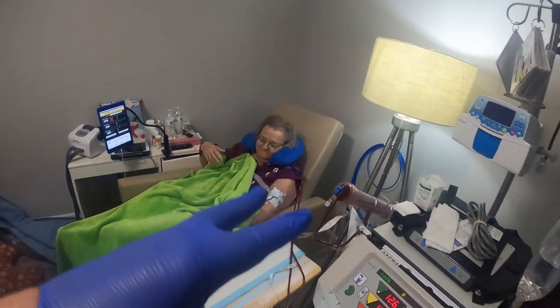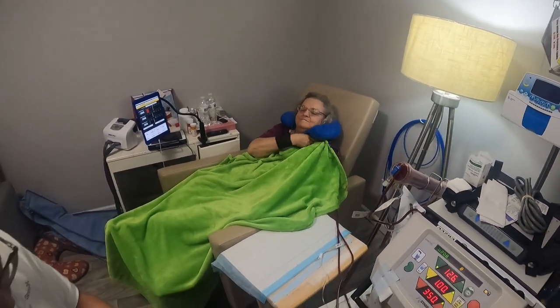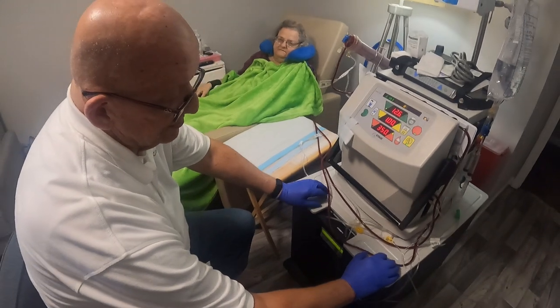It's nothing comparable, but when I overeat, all the blood goes to the stomach to help digest, and you get cold. And all her blood is going in through this process right here. So we talked about dialysate just a little bit.